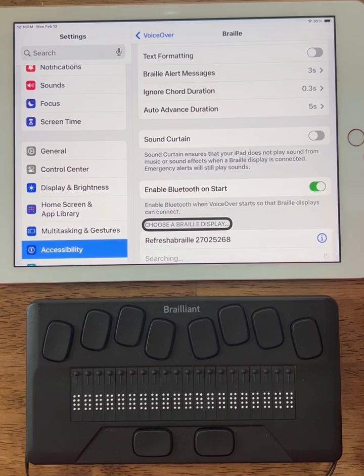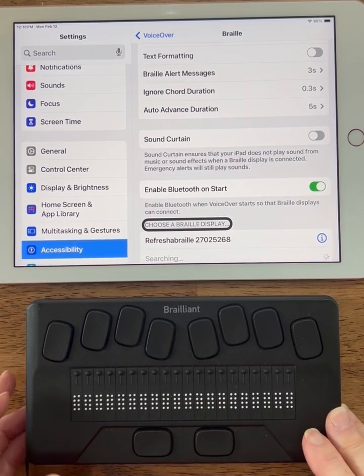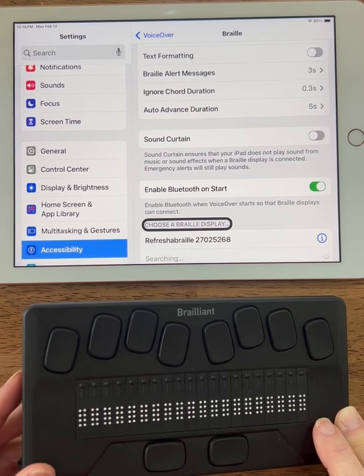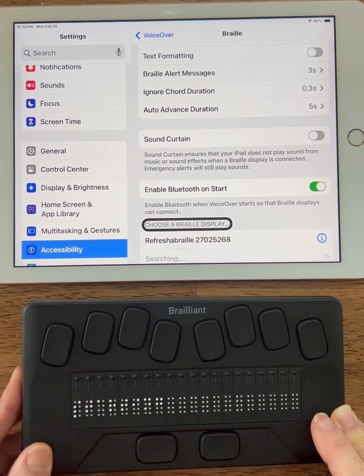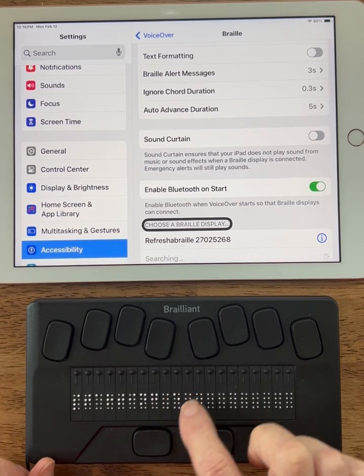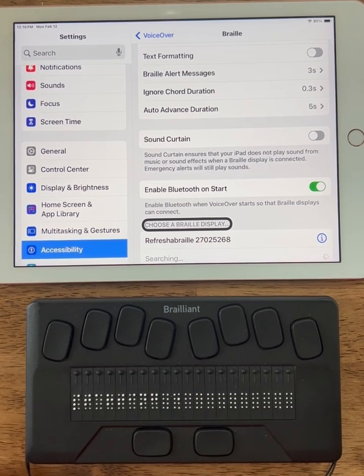Now that I'm on 'Choose a Braille Display,' I'm going to go over to my Brailliant and turn it on. I'm going to wait for it to boot up. It says 'Starting' in Braille and you see the little circle going round and round — that means it's booting. It does take just a second.